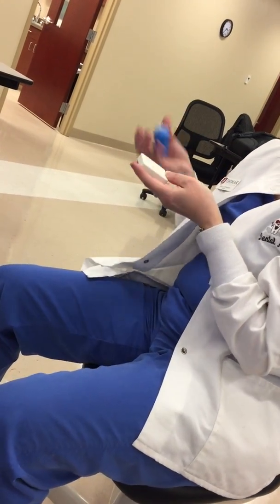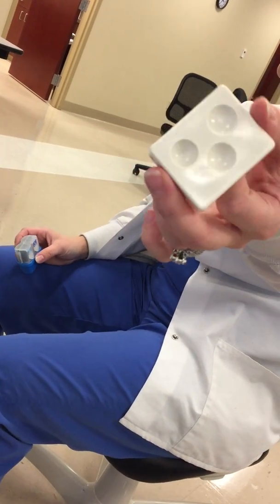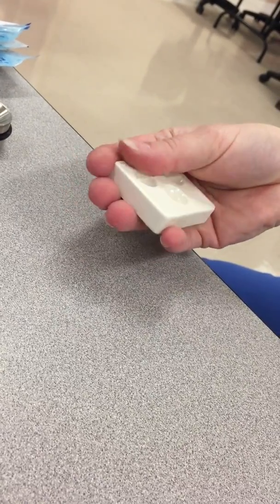Okay. Sometimes you'll see them and they're black with an orange cover because these are light sensitive. So if these are used with light being directly exposed to them, it dries out the material or it sets it prematurely. So anytime you're using composite, it has to have the light away from it. Or you have to cover it. Like with this, I usually set this on top. Or I'll set it upside down so I know which one is in which. Like primers here and bonds here. And then when I go to give it to the dentist, I have my finger covering it and I just move it when he wants to dip it again.